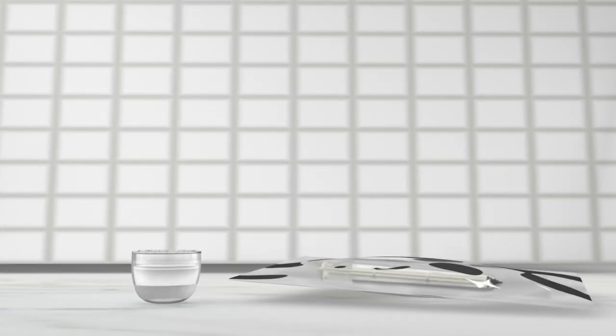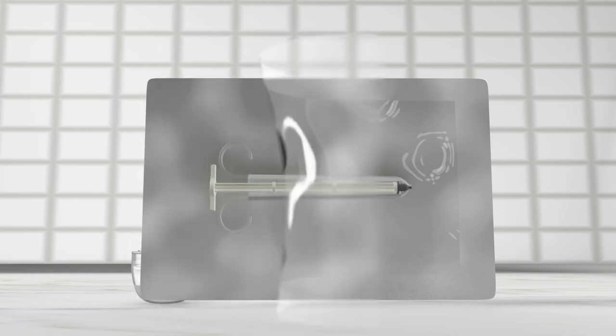Next, let's take a look at the Fertile Syringe, which is carefully packaged to maintain sterility. This syringe is your tool for precise insemination. Let's unwrap it now.